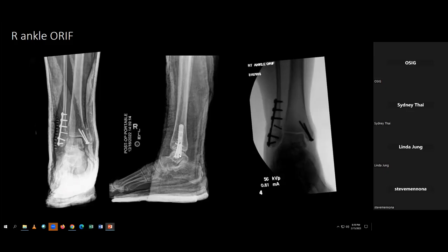There's one screw right there that doesn't go through the plate. That's called a lag screw. If you look at this part, the fracture line is kind of like this, and the screw is going across the fracture site. The point of that is to bring those pieces together, like Jomar was talking about. The threads will bite and the head will stay, so it compresses the fracture site. But that one screw alone isn't going to be strong enough to hold when you're walking on it. So you typically support that with a plate on the side. And with this plate, you have 3 screws proximally and 2 screws distally.